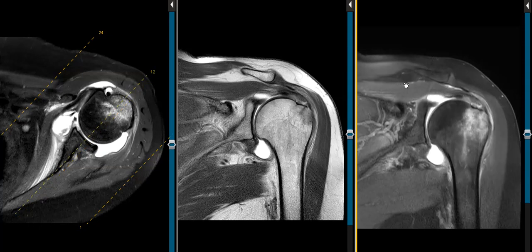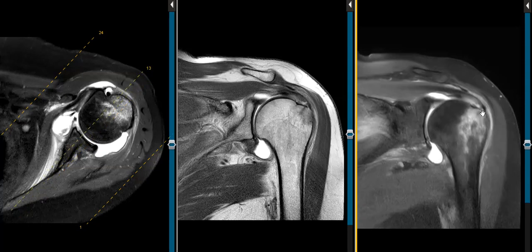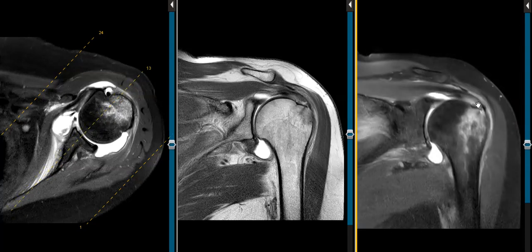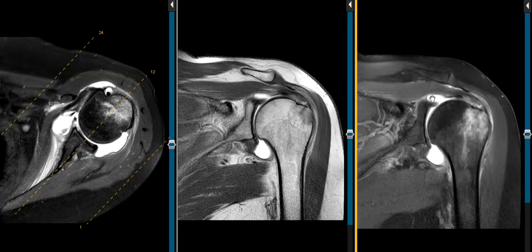The rotator cuff — the supraspinatus — comes over here, and at the attachment we see there's a high-grade partial thickness tear on the undersurface. So it's not completely torn, but we see contrast going up underneath here and we just see a small thin rim of tissue along the bursal surface hanging on. So this is a high-grade partial thickness undersurface tear.